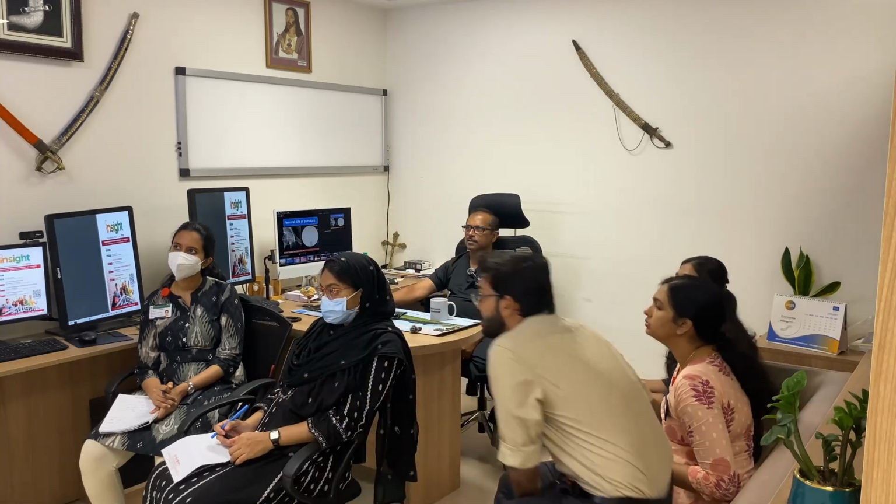When you look at the angiogram, you will see the arteries coming, and below that the bifurcation takes place, and the problems will be much greater.